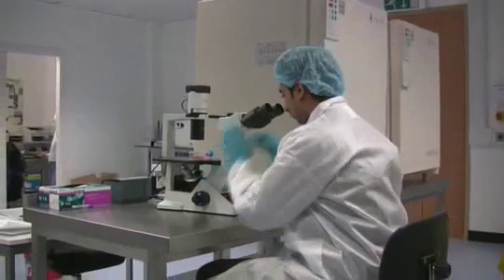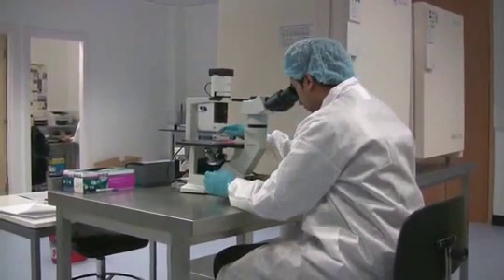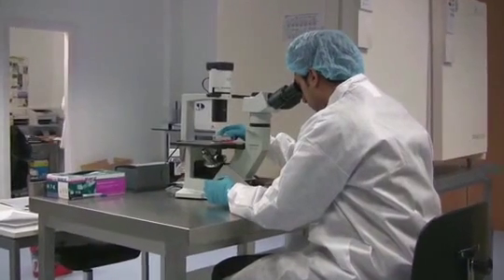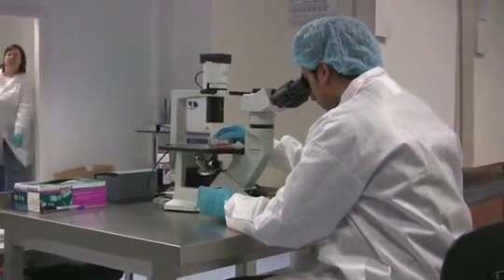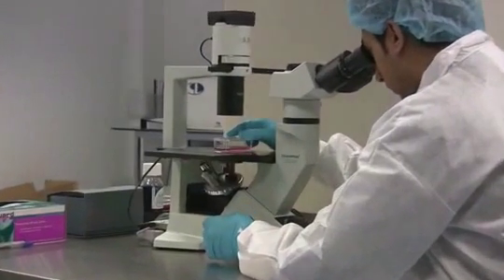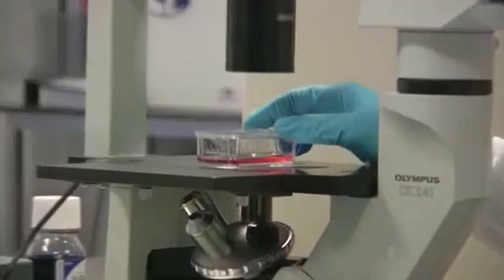If the tooth is contaminated or if no cell growth is noted, then the process is terminated by day 12. In this case, we will send out another collection kit for your child's next baby tooth. We will repeat our laboratory process free.